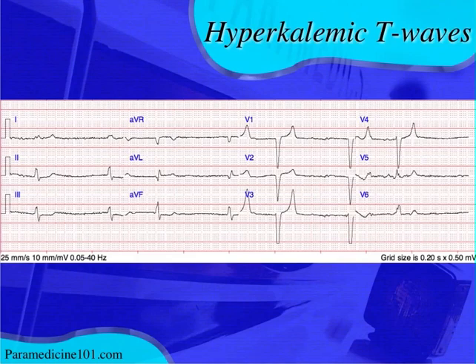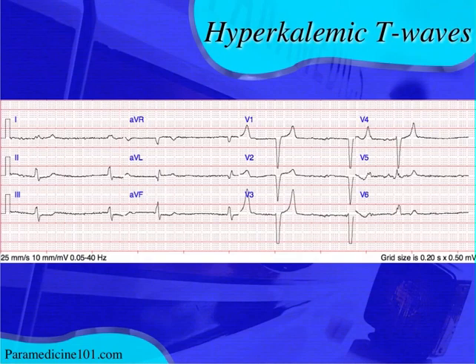Here's another example of a hyperkalemic T wave — narrow, symmetrical, and tall. Whenever you see the ST segment kind of go into the T wave, imagine drawing a straight line down and you'll see it is actually a symmetrical T wave. Those tall narrow symmetrical T waves — you need to be concerned about hyperkalemia. And it has to fit the patient. Don't just say 'I see big T waves, it's hyperkalemia' — it's got to fit clinically.